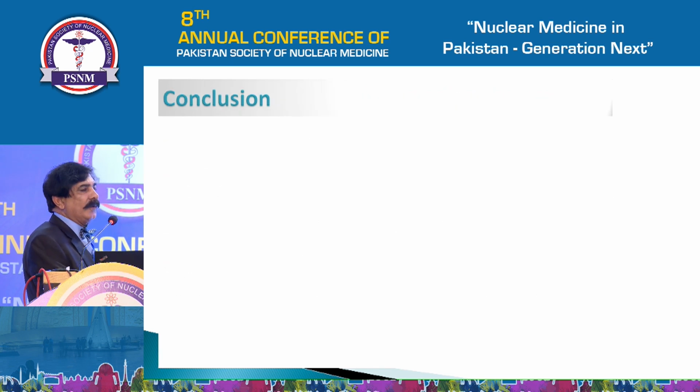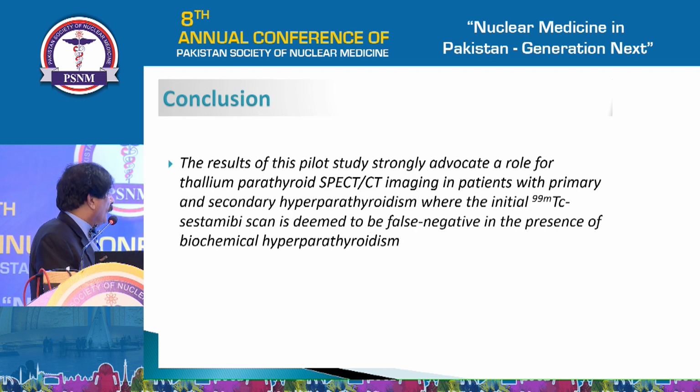Because planar thallium imaging was superseded by planar MIBI imaging, owing to its superior physical characteristics, thallium imaging was abandoned. But when you do a thallium SPECT CT, it can not only provide a physically and technically equivalent result, but because of the biological characteristics it is superior.